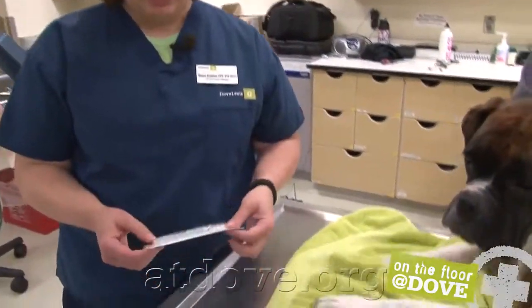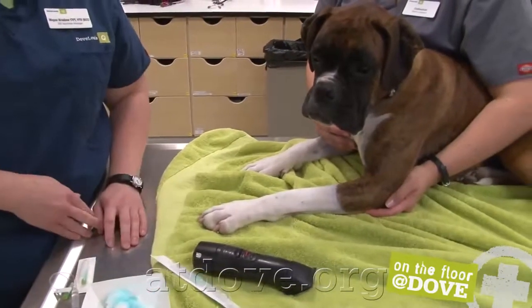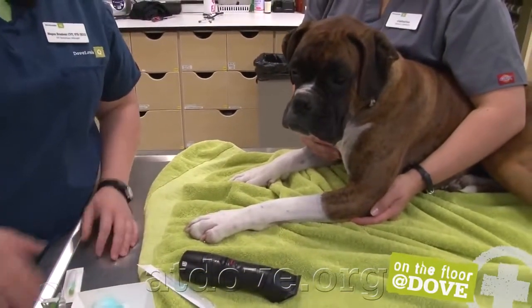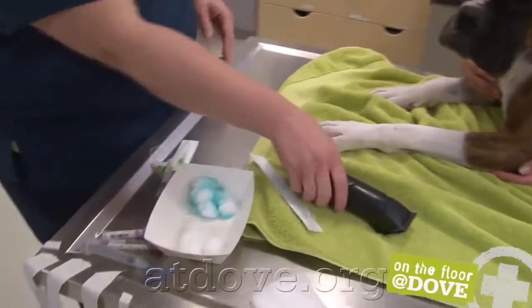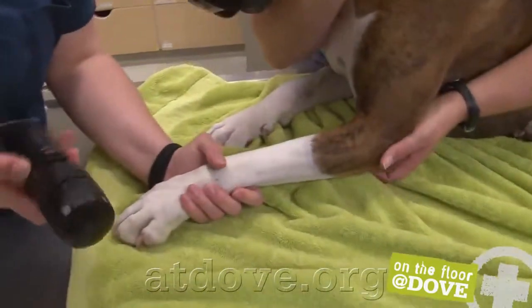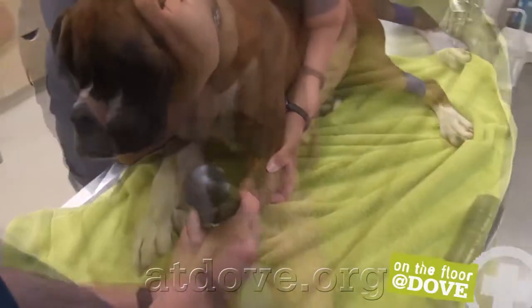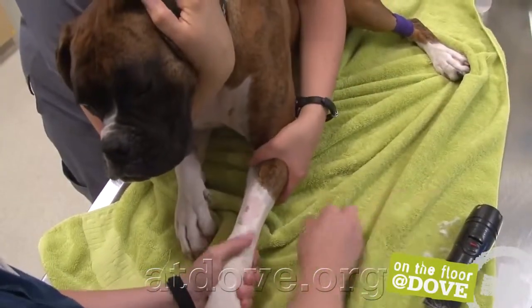I've got my catheter picked out. In this size dog, an 18 gauge catheter is a good choice, so I've got one of those. All of my tape is torn, my scrub is ready. So I'm going to get started by clipping a nice rectangle of hair over the cephalic vein. Clear all these little hairs out of the way.